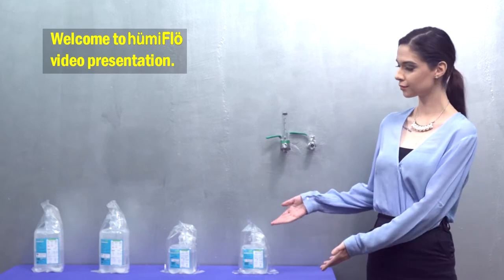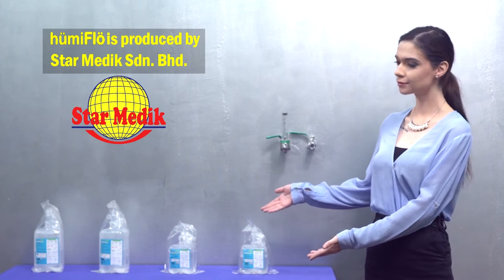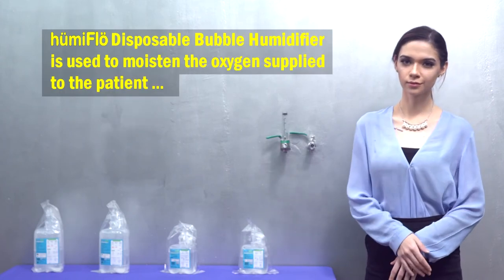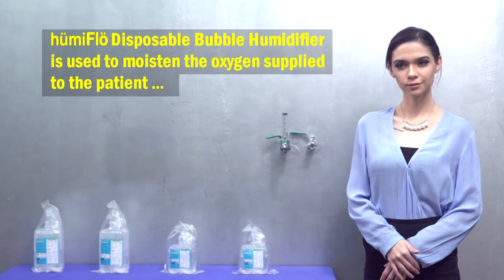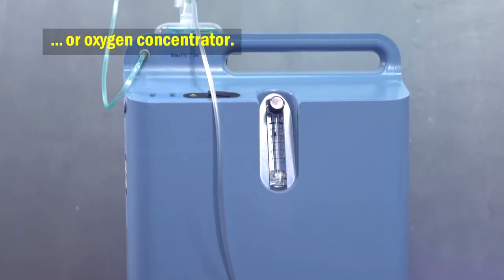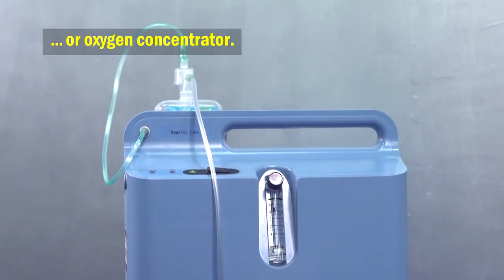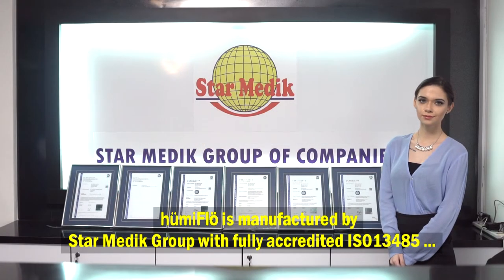Welcome to Humiflow video presentation. Humiflow is produced by Star Medics. The Humiflow disposable bubble humidifier is used to moisten the oxygen supply to the patient, either through an oxygen flow meter or oxygen concentrator.